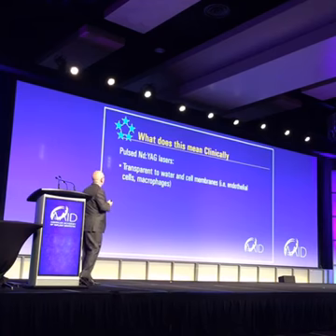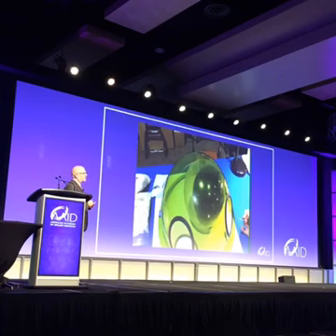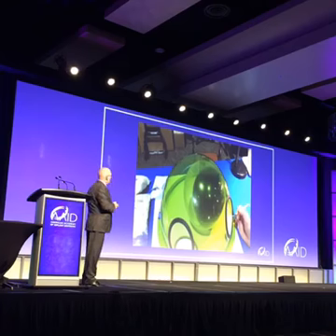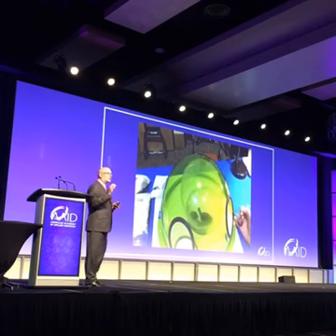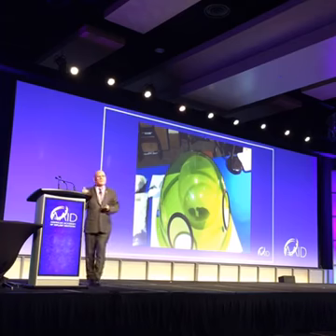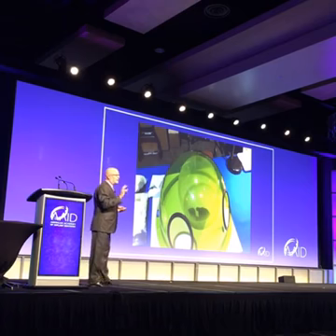What we'll see is that pulsed Nd:YAG lasers are transparent to water and cell membranes. You'll see this a little later. It's highly absorbed in dark pigment, and it's well absorbed in hemoglobin, and not well absorbed in connective tissue. Let's go on. I think this really shows what the Nd:YAG can do. This really shows the specificity of the Nd:YAG laser. No other laser can do that. The erbium can't, and a CO2 can't, and a diode can't, because of how the Nd:YAG is absorbed in dark pigment.